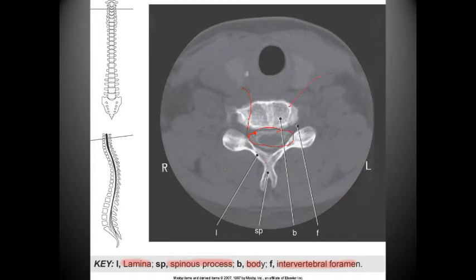But we do have the vertebral body here. We're really not seeing the pedicle very well, but this looks like it might be the transverse foramen. And so the pedicle would be somewhere in here. And we're seeing this area being the lamina, which brings us to the bifid tip of the spinous process.